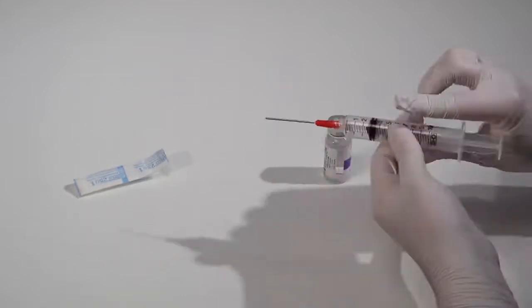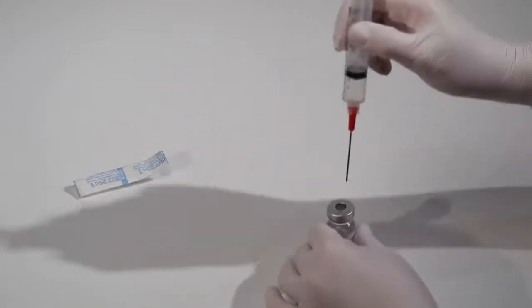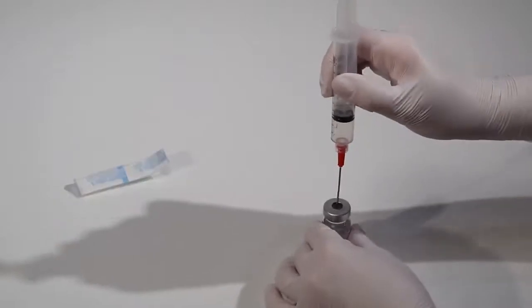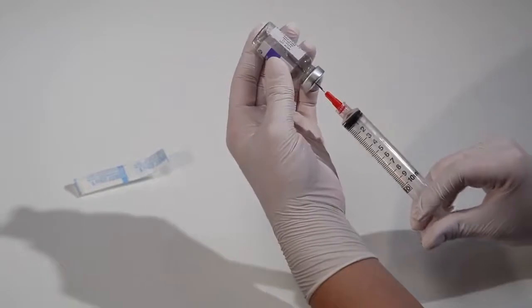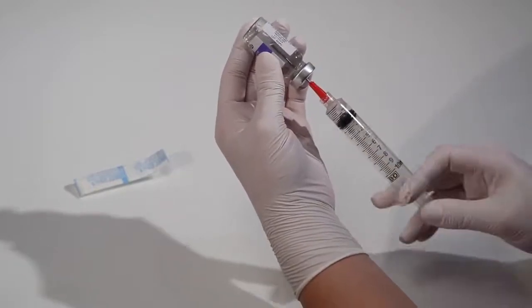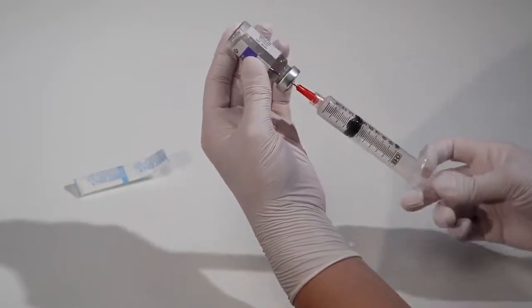Insert the needle into the center or thinnest part of the vial stopper and inject air. Remember that over-pressurizing the vial can lead to leakage or spray. Then, hold the vial upside down while keeping the needle tip in the fluid.